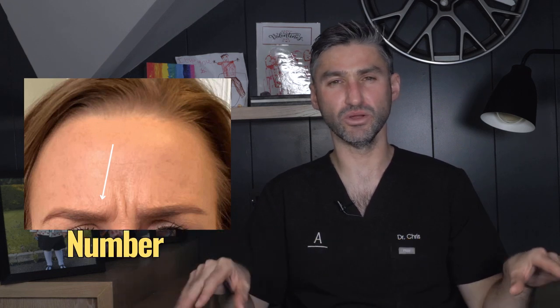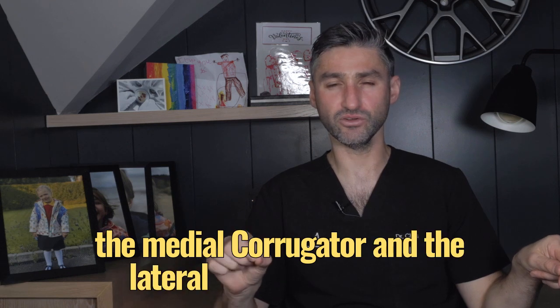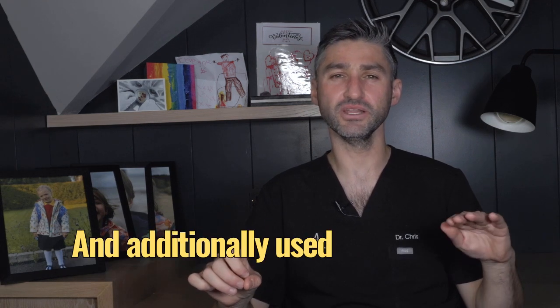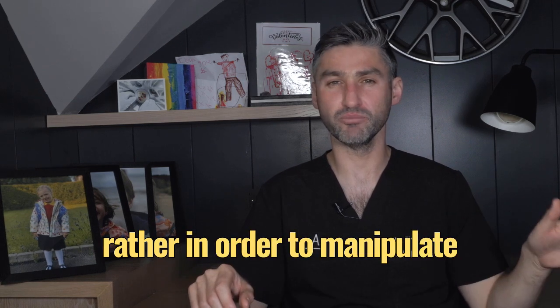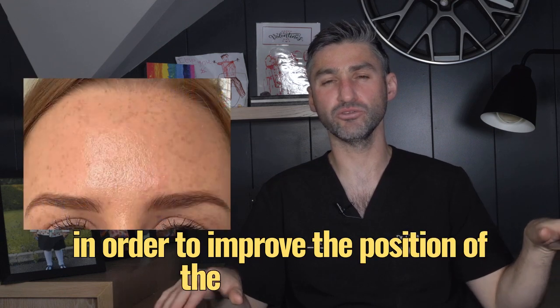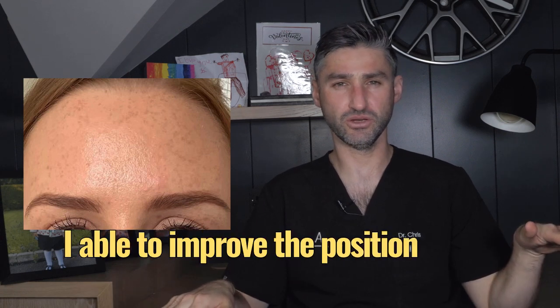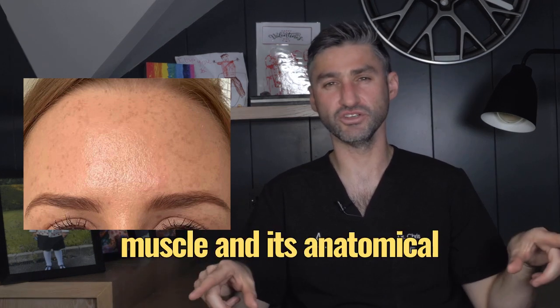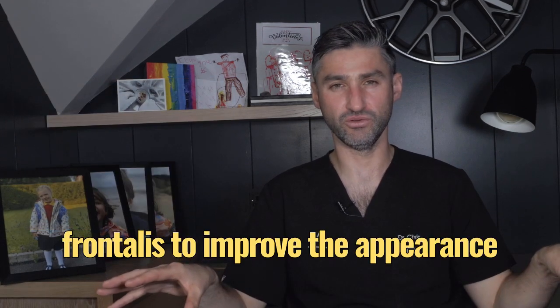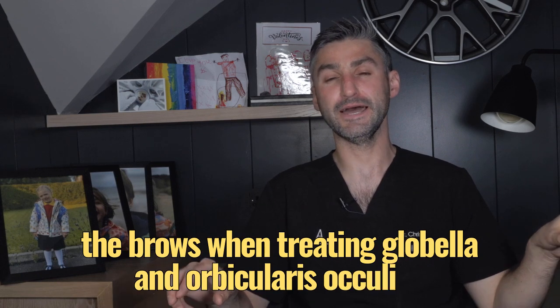So what I've done in this case is a couple of things. Number one, treated the glabella in the usual way but used a little bit more toxin to treat the medial corrugator and lateral corrugator on the right with a slightly increased dose. Additionally, I used a little bit of toxin on the right medial or middle portion of the brow in order to manipulate orbicularis oculi a little bit, to improve the position of the lateral brow and improve the appearance of the asymmetry. Not only was I able to improve her brow asymmetry, but the nature of her frontalis muscle and its anatomical distribution allowed me to both treat frontalis to improve fine lines while also manipulating brow position when treating glabella and orbicularis oculi.